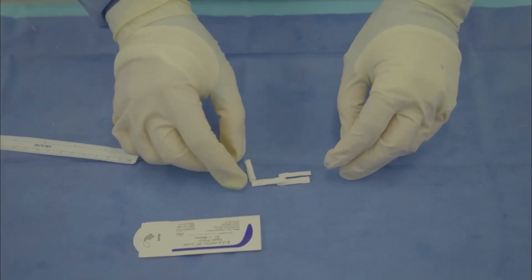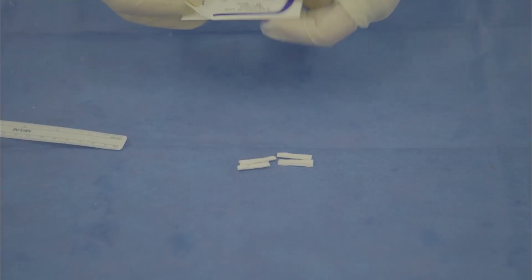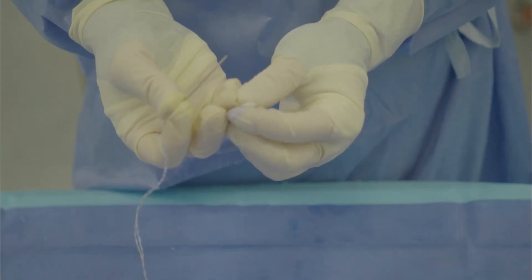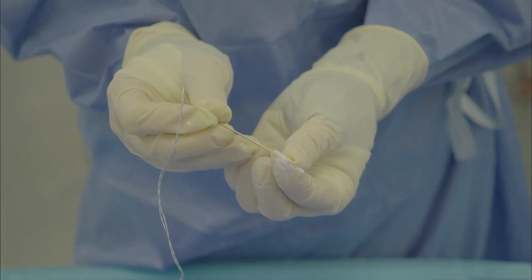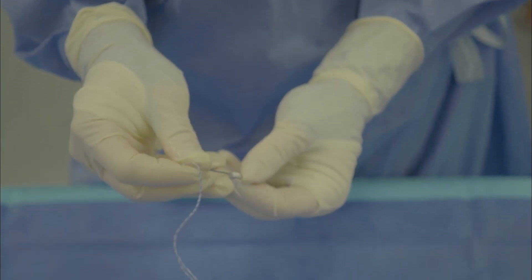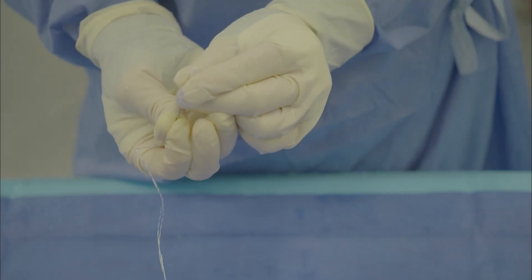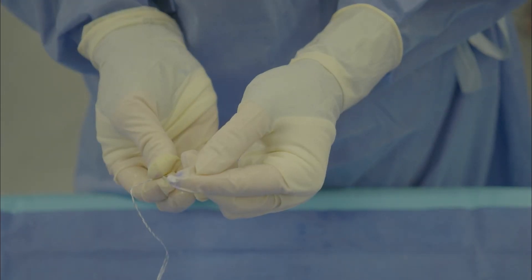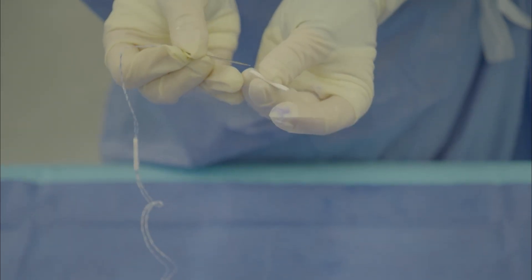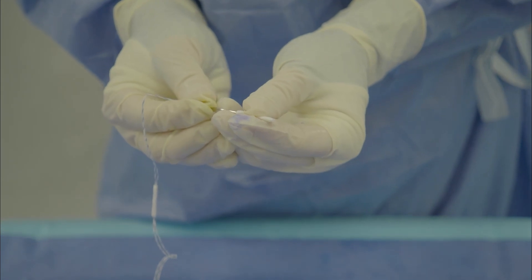So we have our four 25 millimeter BioBrace strands here, and now we're going to use a suture loop with a Keith needle to pass our strands. Passing these through the loop, make sure you go through the center of the BioBrace. You want to make sure you can feel this needle passing easily through. As I'm penetrating the strand, I'm trying to go right in the middle and feel no resistance, going in line with the fibers. I'm taking care to come out through the middle of that BioBrace. We can pass all four strands at once.